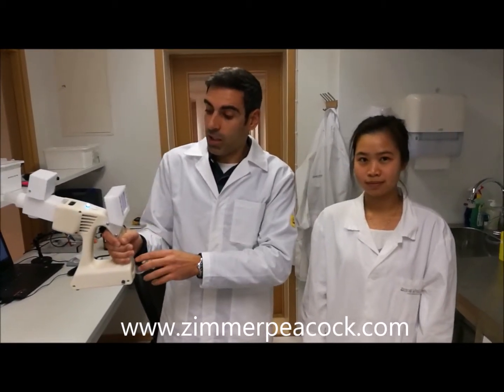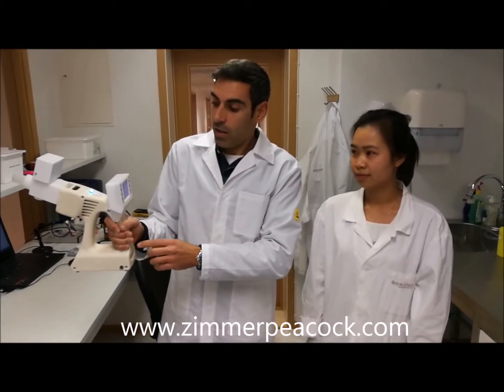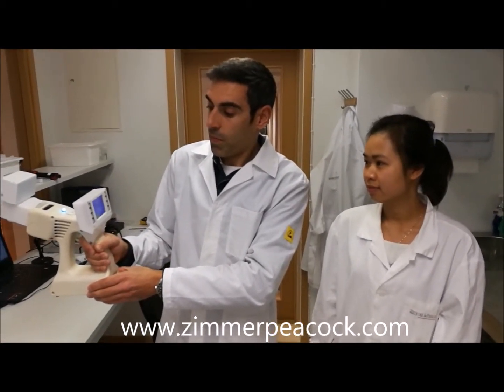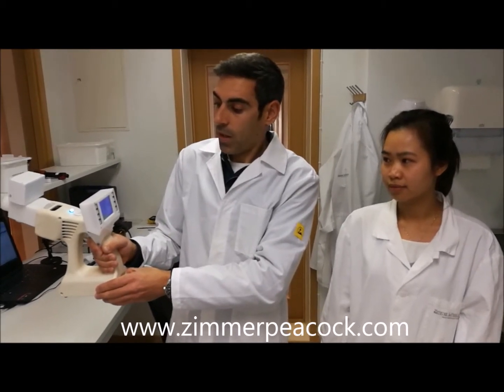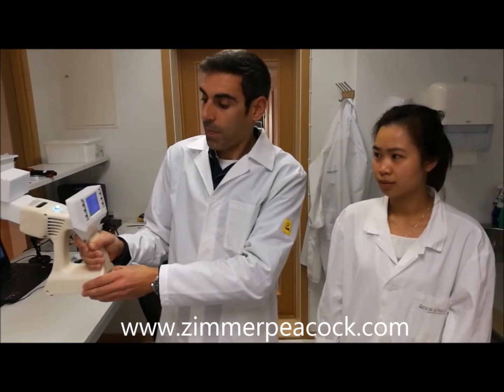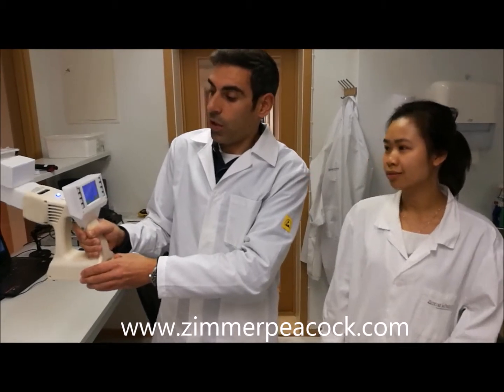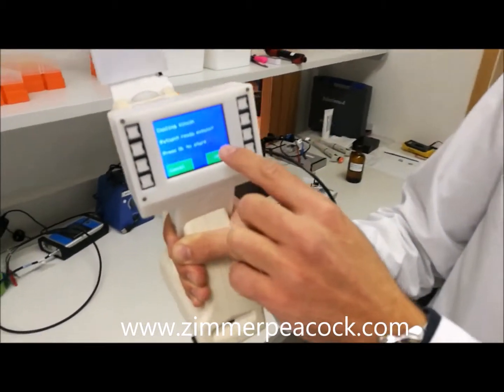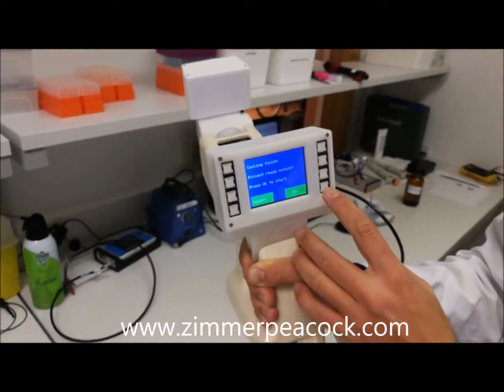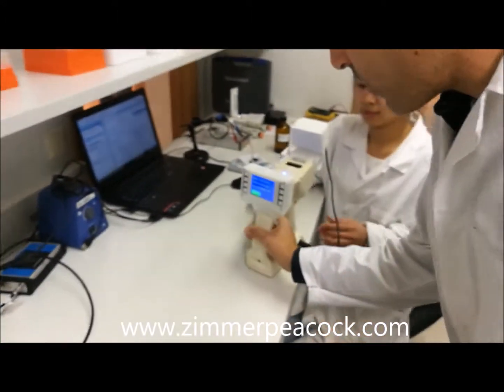This is Nien Ngo, also a scientist at Zimmer Peacock, and she will be the one blowing into the device and collecting the sample. We are now at about 10 degrees — and around 7 degrees as it continues cooling. Once it's ready I'll give her the device. The cooling is now finished and it's asking if the patient is ready to exhale.